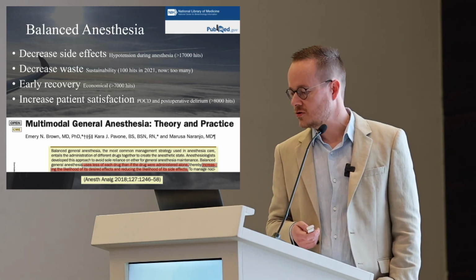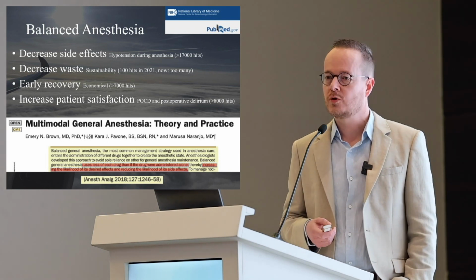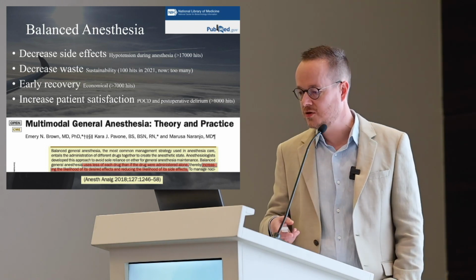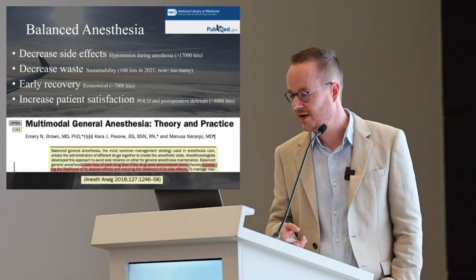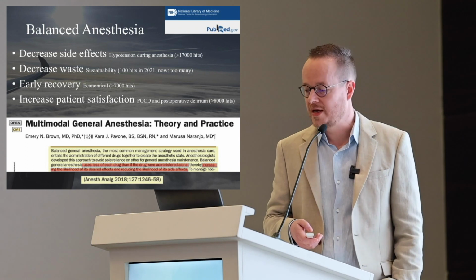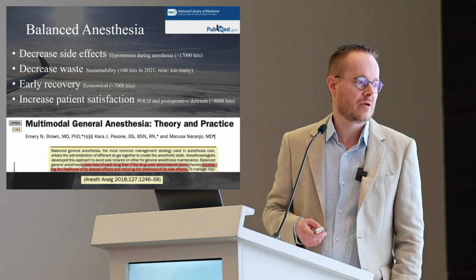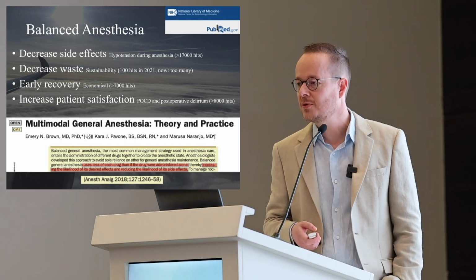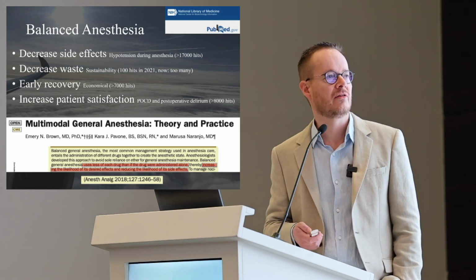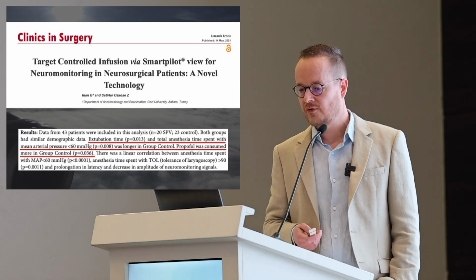Why did I use SmartPilot View? Because I want to give balanced anesthesia. I want to combine drugs in order to use less of each drug and to reduce the likelihood of side effects, like, for example, hypotension. I want to decrease waste. Sustainability is a hot topic nowadays. I want an early recovery for my patients, and if possible, I want to increase patient satisfaction. There's a lot of evidence about all these things right now that they are very important for our patients.